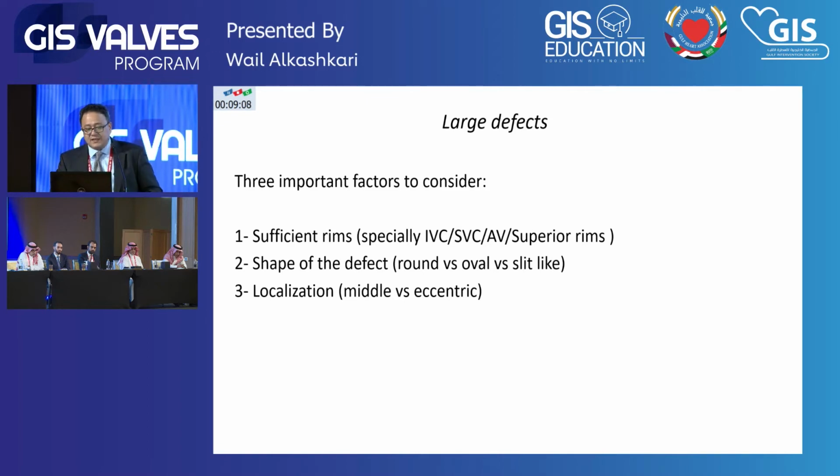Focus on the large defect. Large defects are closable, provided you have sufficient rim. The important rims are the IVC, SVC, AV, and superior rim. As I told you, the superior rim, you will see it with the 3D.